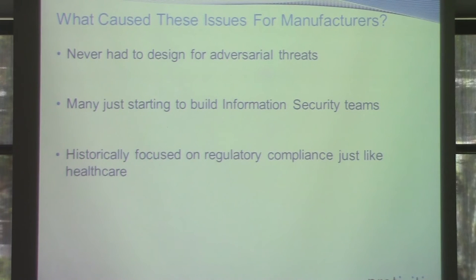Does anyone know when they actually started developing that? Take a guess, anybody? 2013? No. 2005? Closer to 2000. They started with their prototype development in 2001. So you have a 12-year development life cycle to market, and then you have to support the thing for another 15 years. So there is a challenge. It's not like they just completely ignored it, but it is a new threat too, right? They haven't looked at that.